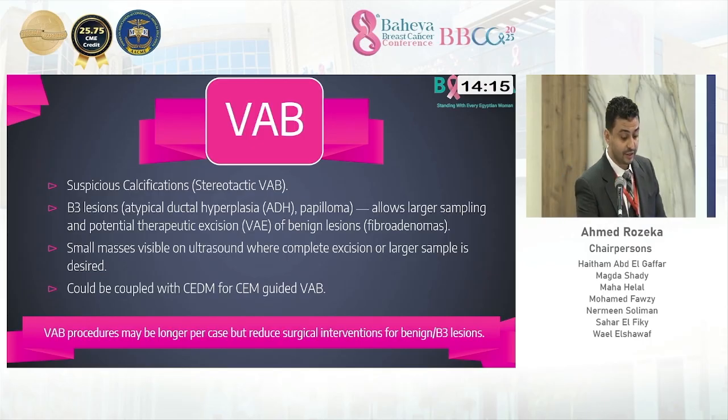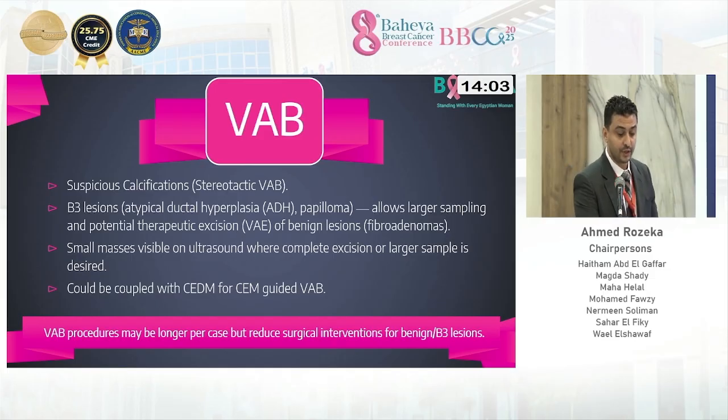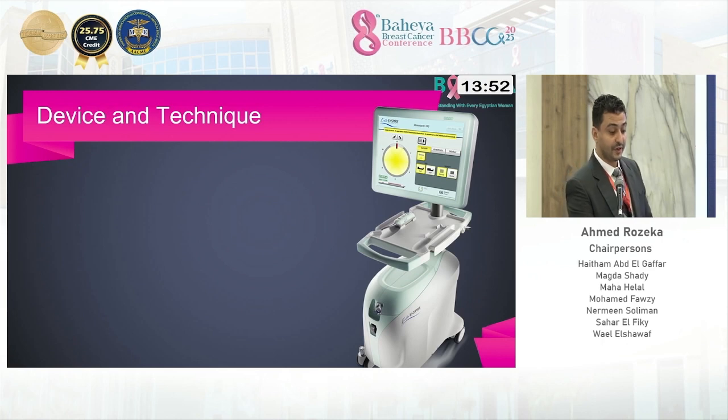It is also used for small masses that are visible on ultrasound where we want to remove the whole lesion or we need a bigger sample, and could also be coupled with contrast enhanced mammography for contrast enhanced mammography guided VAB. Yes, the VAB procedure does take longer than the core needle biopsy, but it's a trade-off because if we don't do the VAB, then we'll have to do a surgery, which will take longer and is more tiresome for the patient. Real quickly about the device and technique.